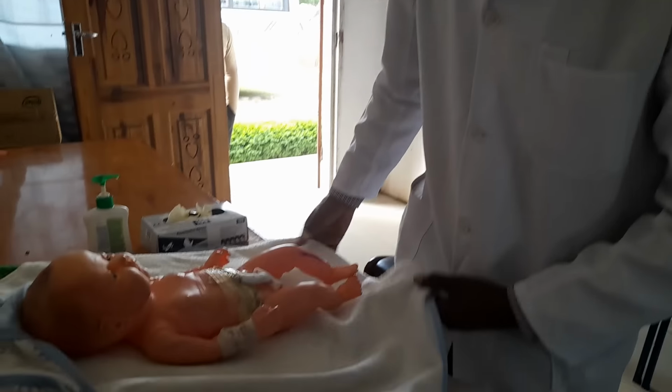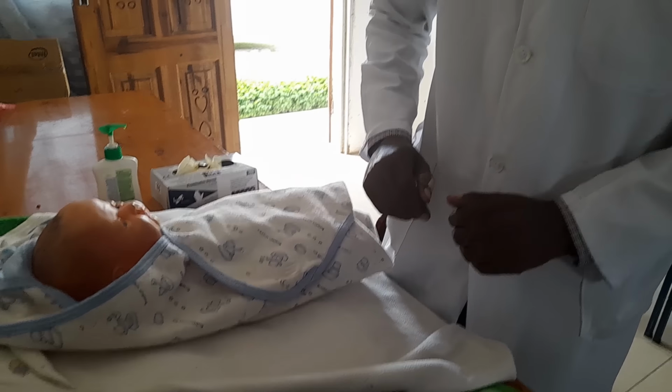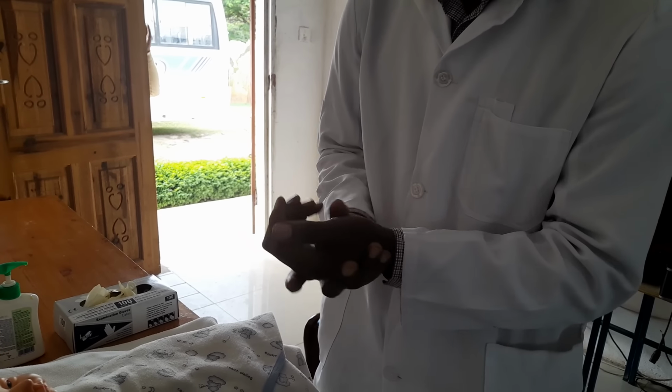As we start the procedure, you see the first steps to follow. This is happening in the delivery room, or in theater, or maybe in the labor ward. You start by applying hand sanitizer. Then the examiner will tell you to perform neonatal resuscitation. The first thing you're supposed to do is call for help. You're going to shout, "Help! Asphyxiated baby!" Then everybody nearby, the nurses, will come to give you help.